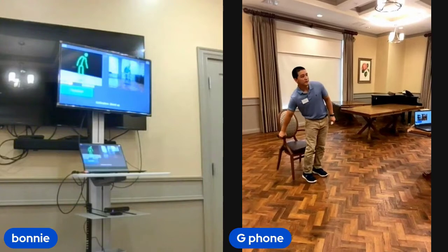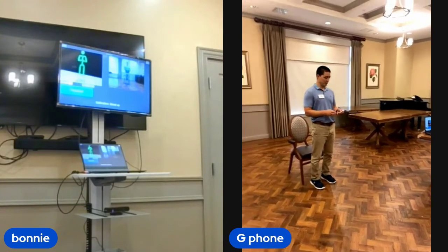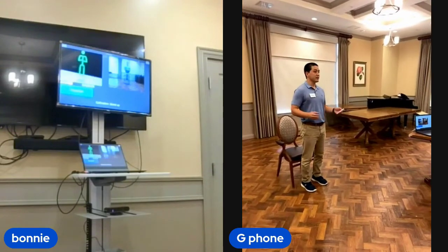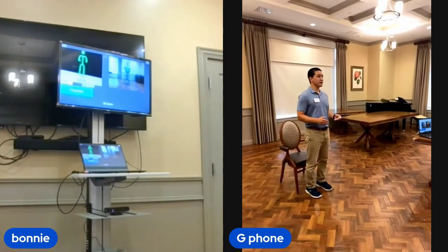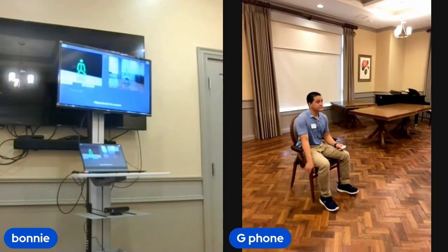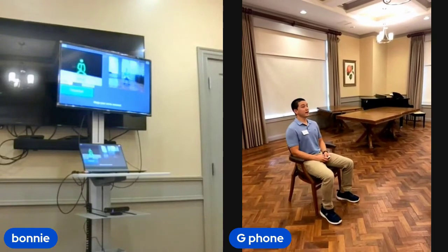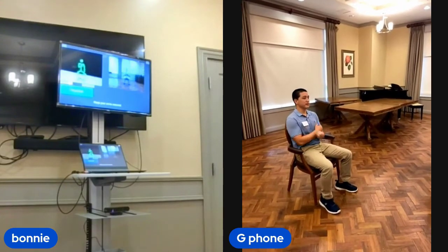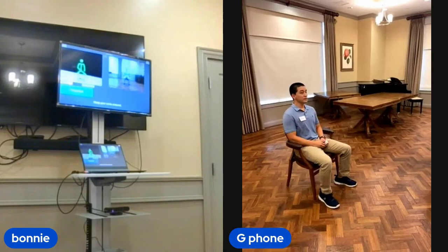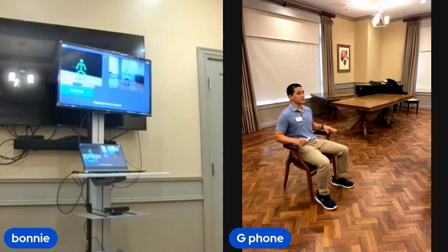Alright, so stand up. It gets your height, so you have the resident stand, it gets their height. Calibrated. Sit down in the chair with your arms crossed over your chest. At the toe, stand up and sit down 5 times as fast as you can. Ideally, you would have their arms crossed, but for most of our residents here, they won't be able to do this, so you can do this with your arms on the armrest.